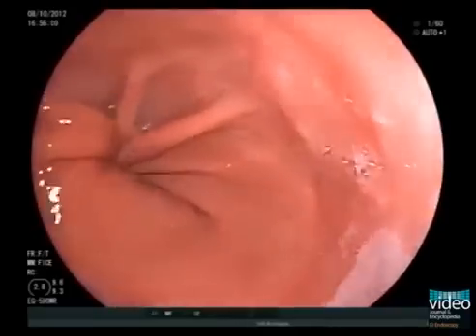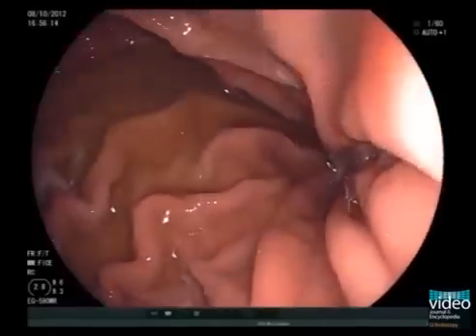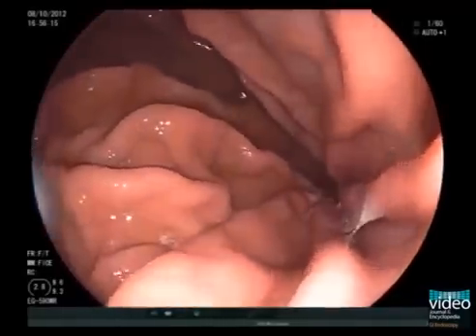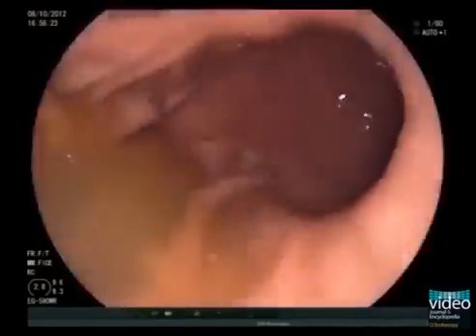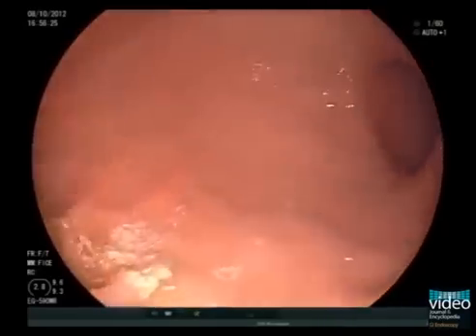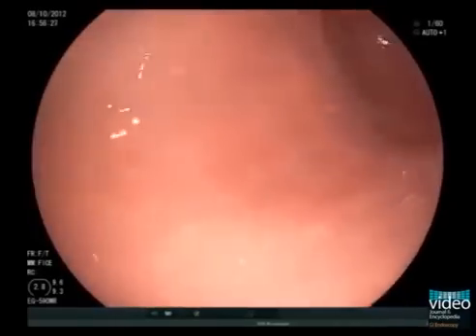Now advance the scope into the stomach and align the tip along the longitudinal axis of the stomach by means of a 60 to 90 degrees clockwise torquing maneuver. There are certainly many ways of examining the stomach. The important point is to be both systematic and deliberate so as to minimize the amount of unexamined surface area.